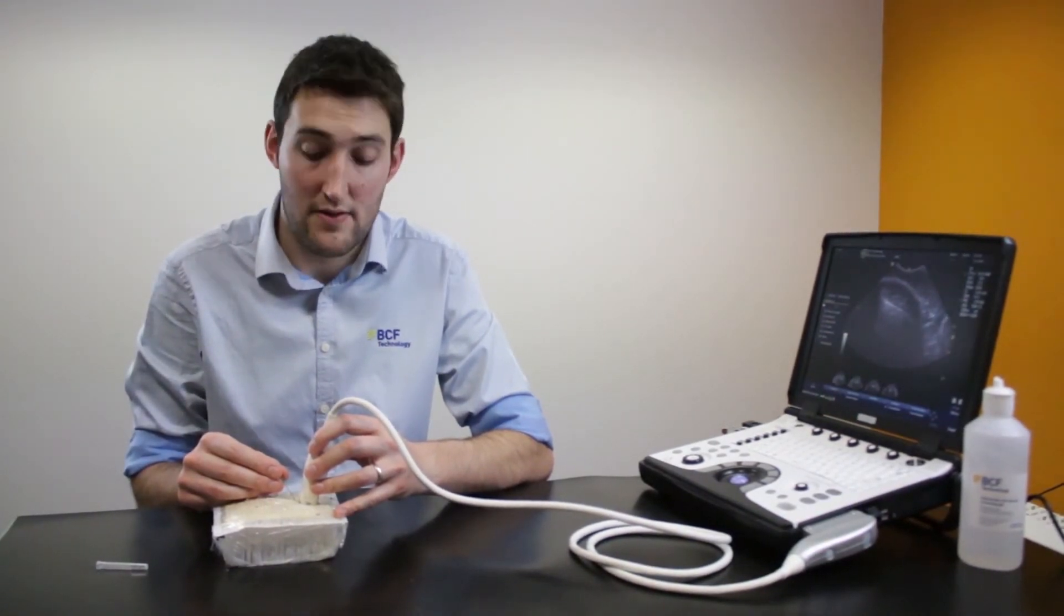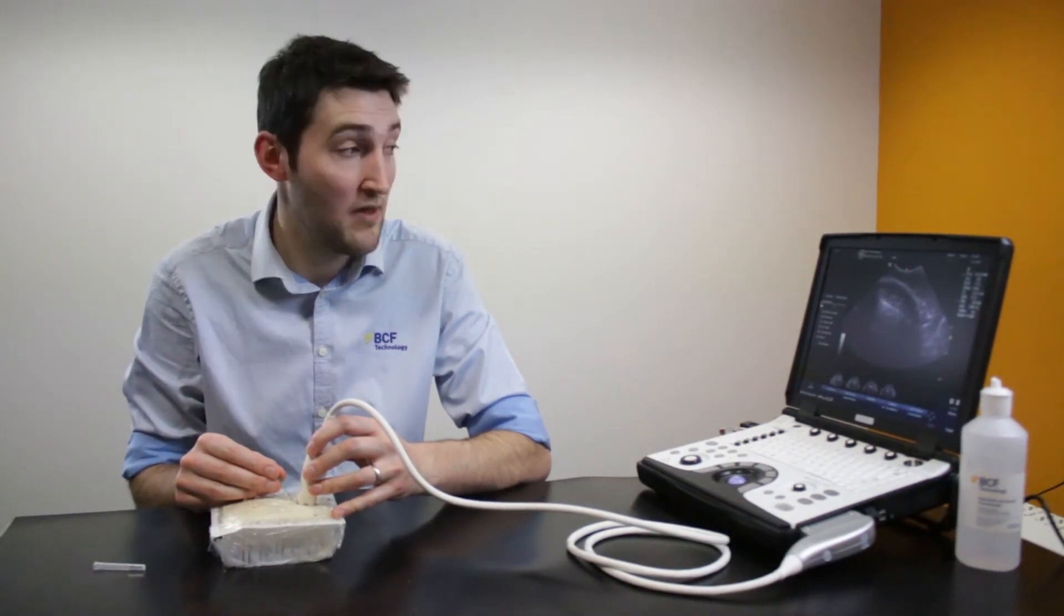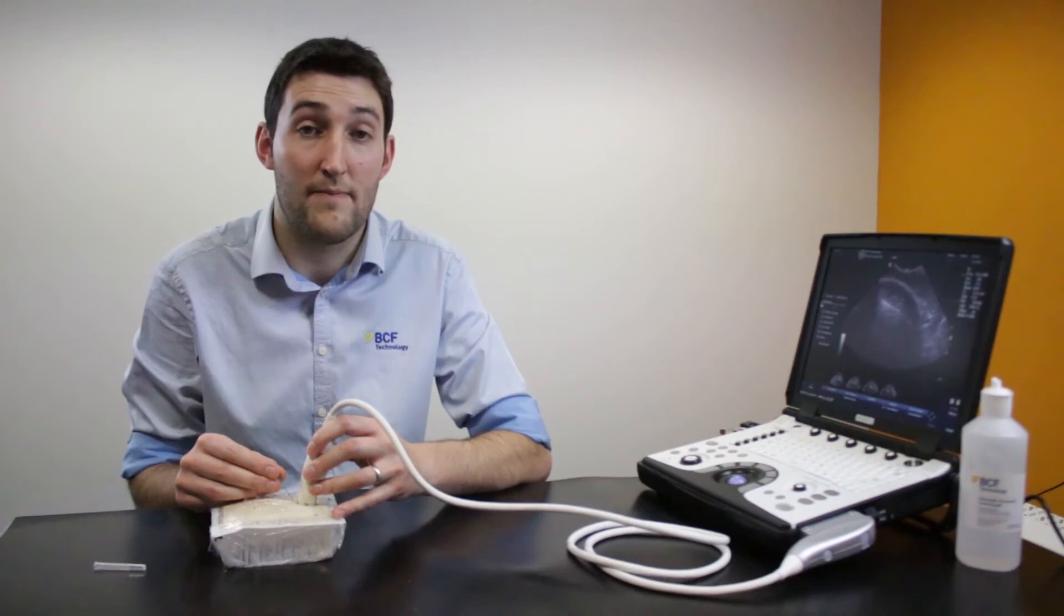Once the needle is in place, leave the needle where it is. If you lose the needle from the shot, leave it where it is and bring the ultrasound probe to the needle.